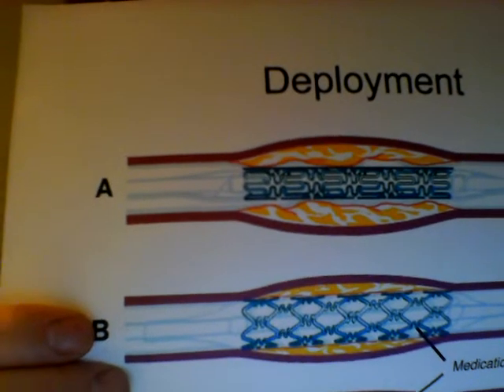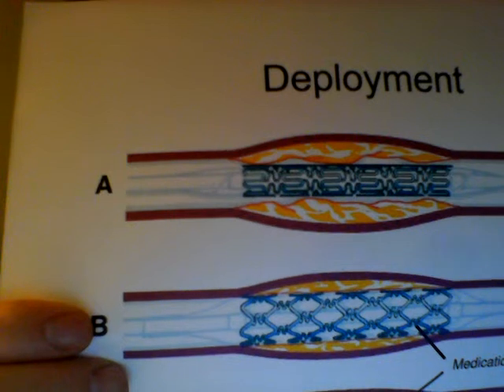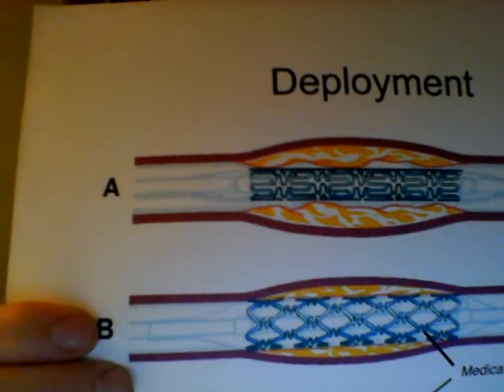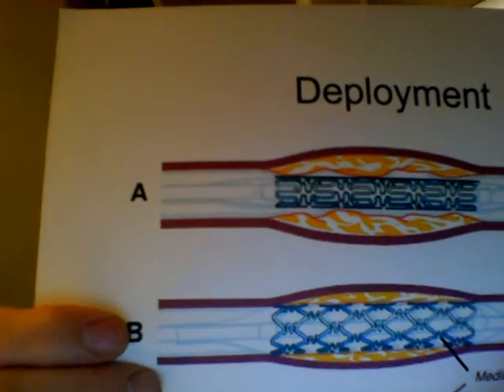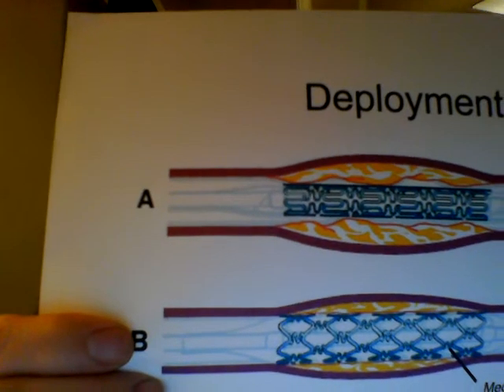The stent will then expand, and it will brace itself up against the wall of the vessel, pushing the plaque out of the way and allowing for a clear passage. As you can see below, when the guide wire is pulled out, a clear passage for blood to flow. When that blood starts flowing back, it then starts feeding the heart again, and the heart muscle can continue living, continue pumping, and presenting itself as a healthy patient.